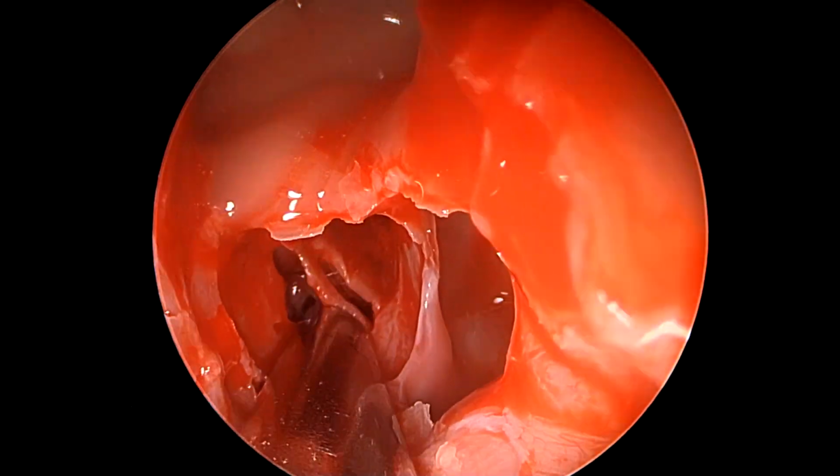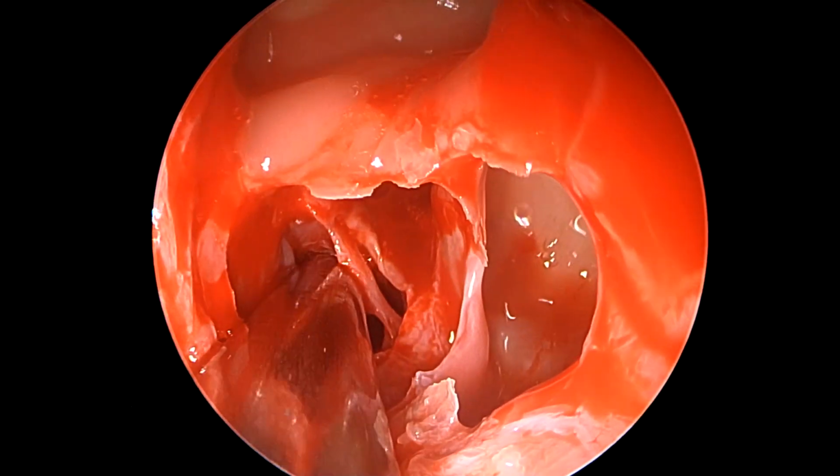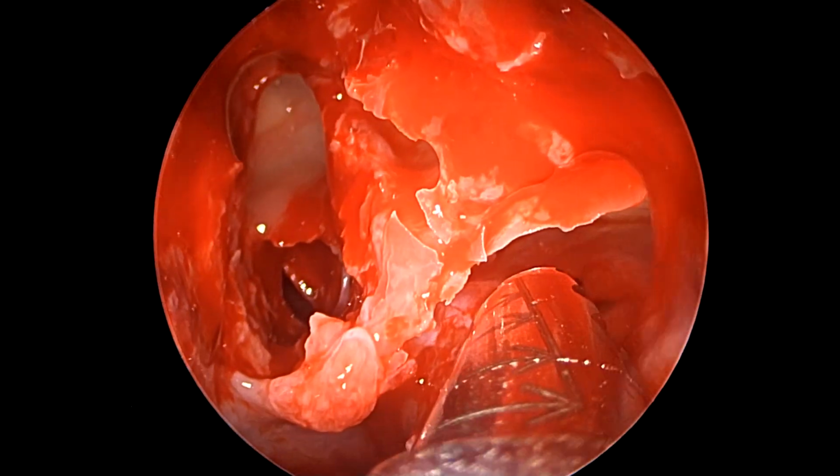We can see here the inferior portion of the superior turbinate being trimmed with the microdebrider blade, and medial to the superior turbinate is our sphenoethmoidal recess, which guides us towards the sphenoid sinus. Lateral to the same is the ethmoidal cavity.